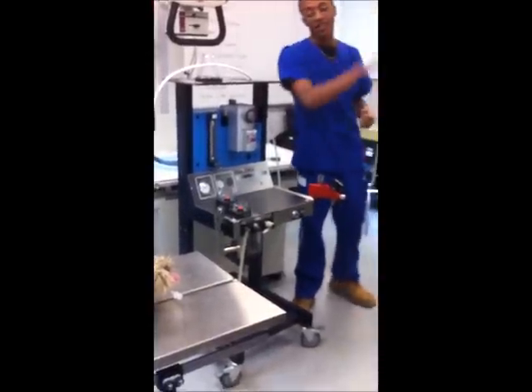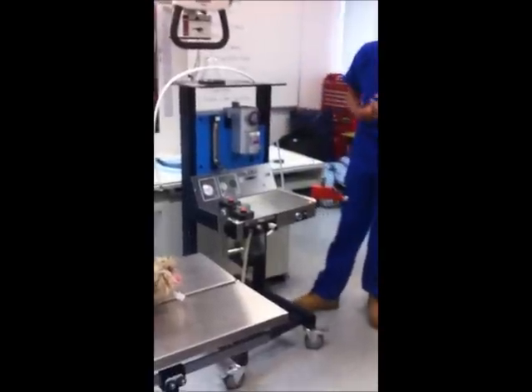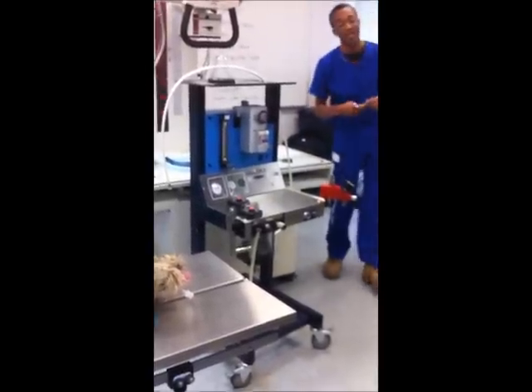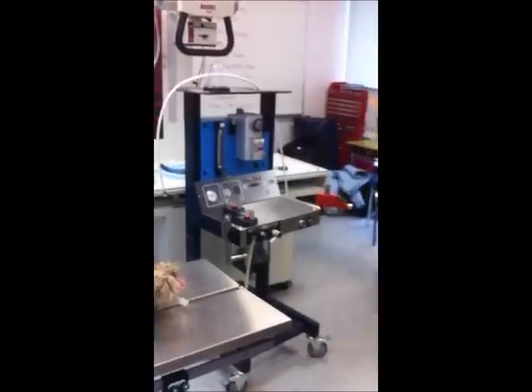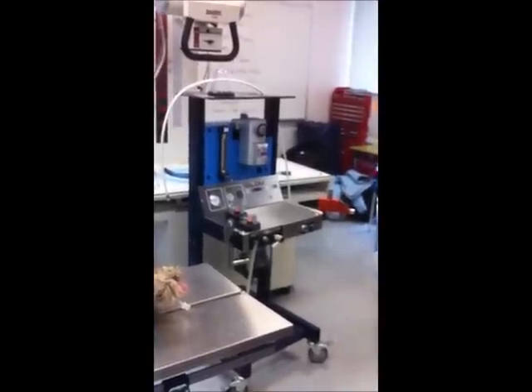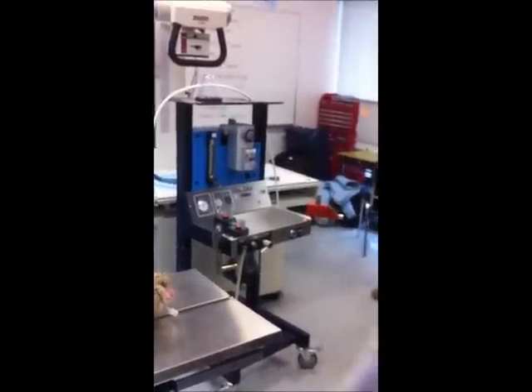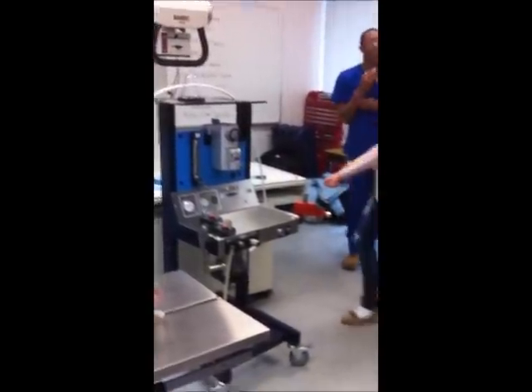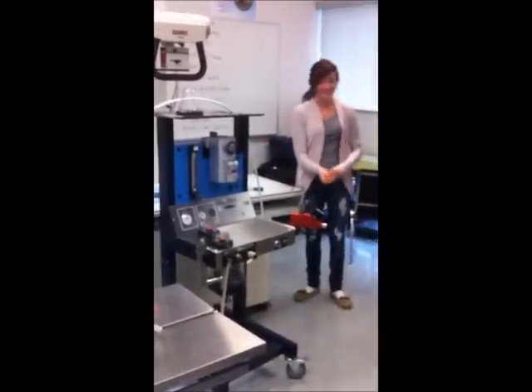Okay, so 10 kilogram dog Bruno needs to be hooked up to the anesthetic machine. And because you won, you selected yourself to come and hook up the anesthetic machine. So you come do that first. You just voted yourself to come out. What am I doing? You're just hooking up Bruno to the anesthetic machine.